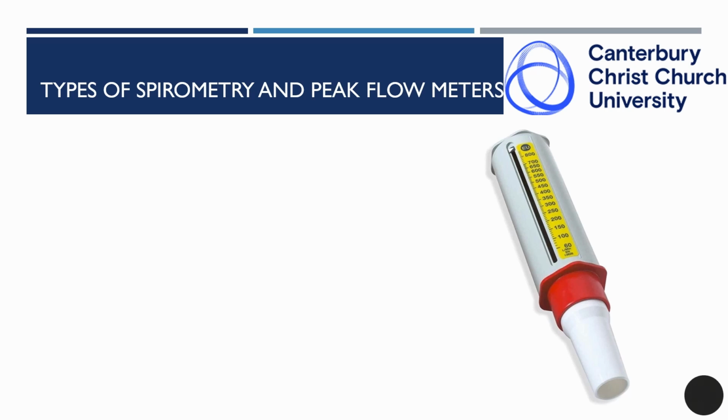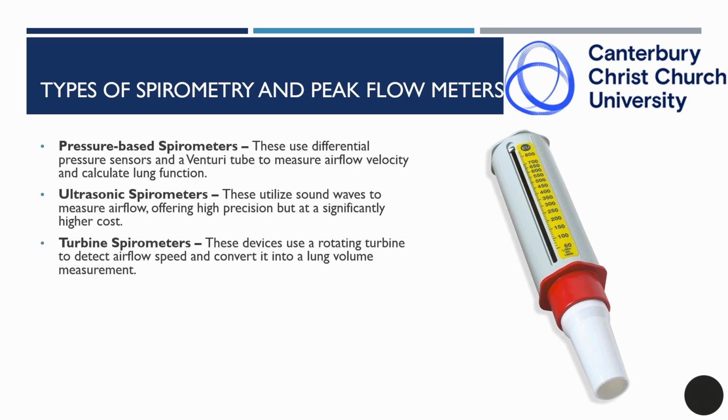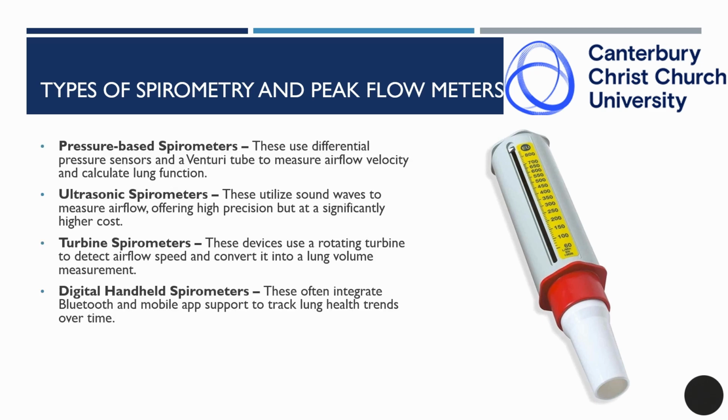Spirometry devices come in various designs, each with unique mechanisms for measuring lung function. Understanding alternative technologies helps us position our Arduino-based spirometer as an effective, low-cost alternative. The most common types of spirometry devices include pressure-based, ultrasonic, turbine spirometry, and digital handheld ones as well.